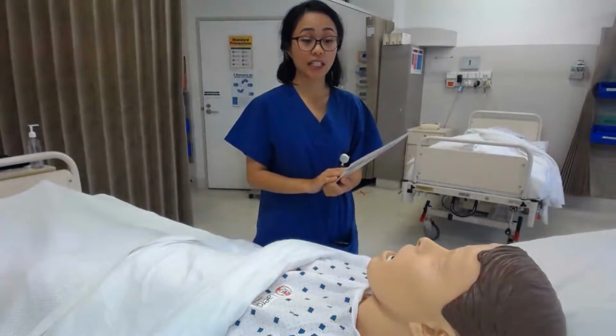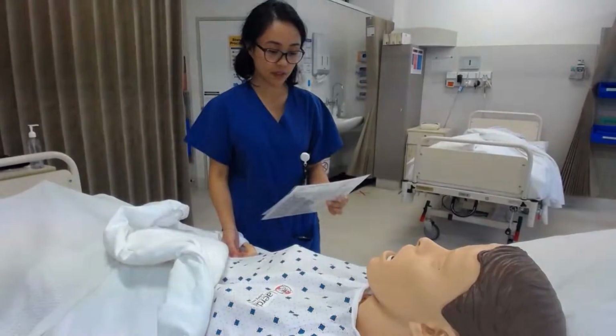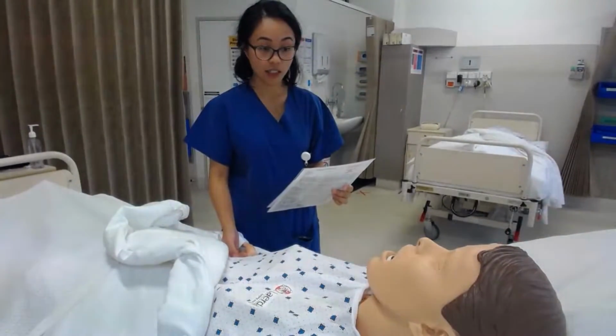When confirming patient identity, ask the patient to state their full name and date of birth. Use the medication chart and the patient armband to confirm full name, date of birth, and medical record number.